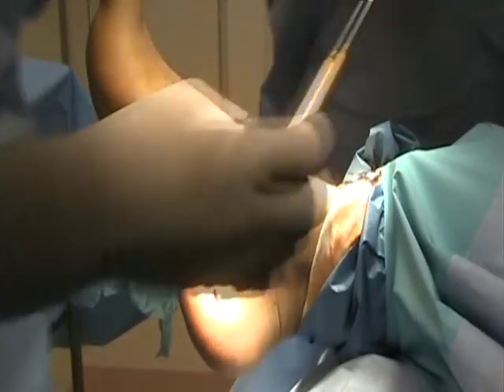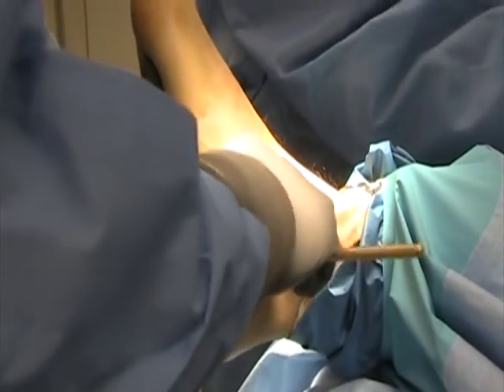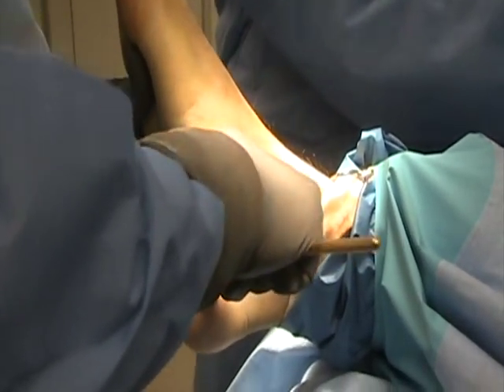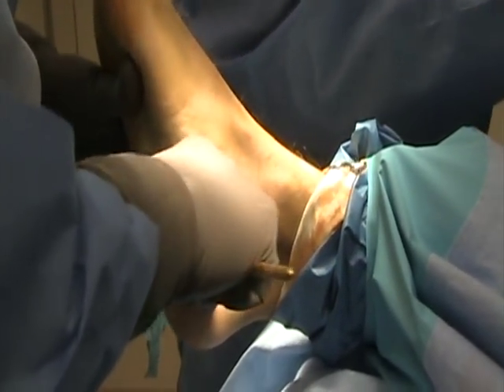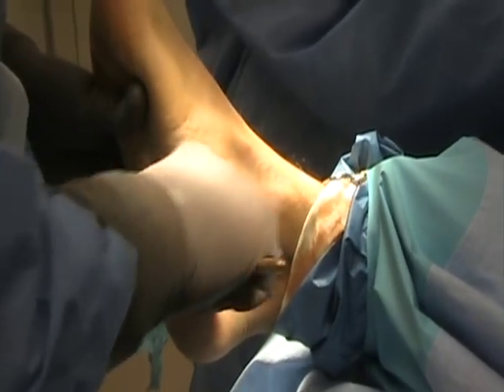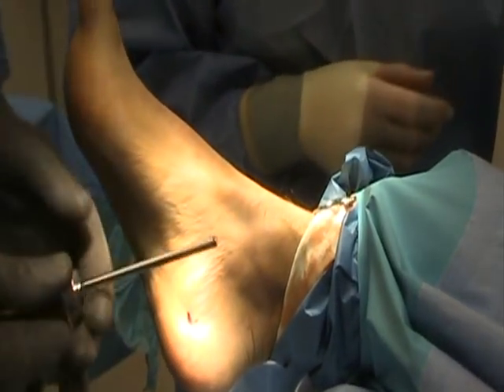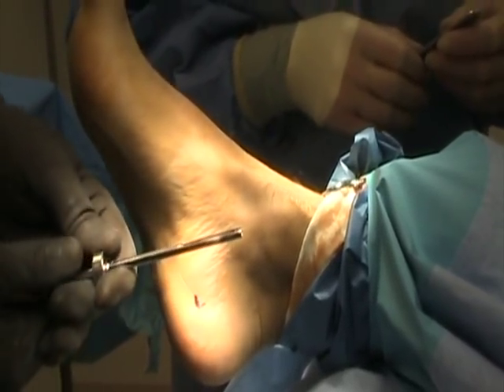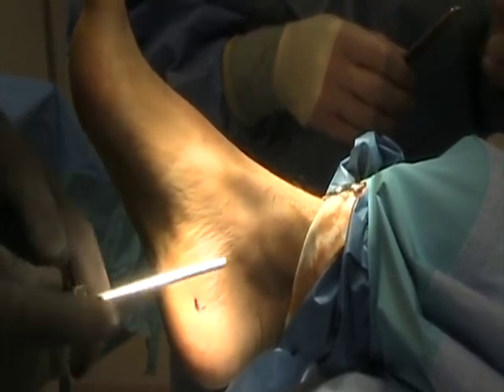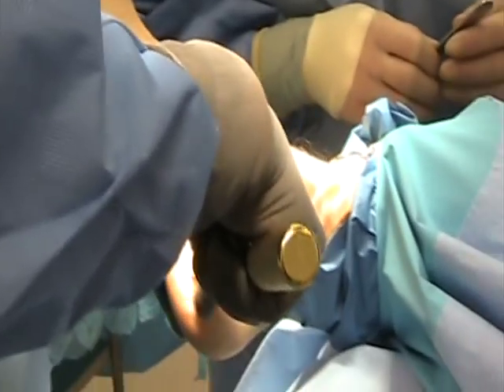You take a little blunt elevator. We've got an obturator and cannula — it's a slotted cannula, you can see the obturator fits into the slotted cannula. We're going to face the slotted cannula up towards the fascia, so we're coming in immediately underneath the fascia, superficial to the fascia.